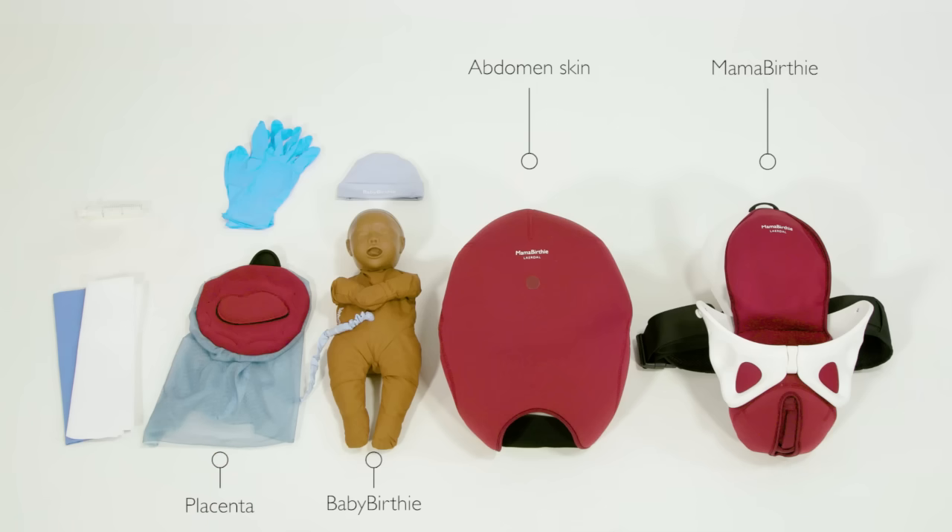In addition you will need protective gloves, a syringe, towels and a cap for BabyBirthie.